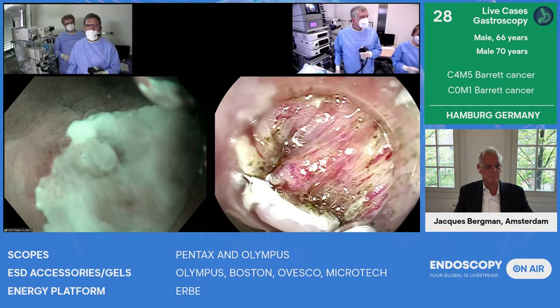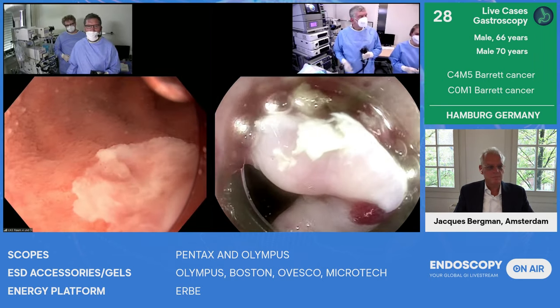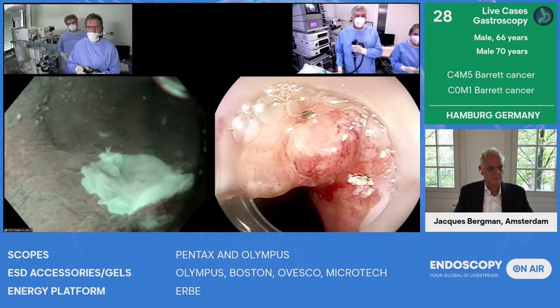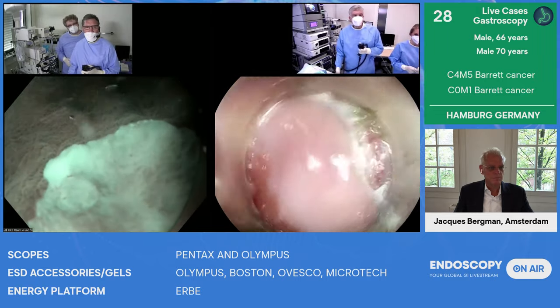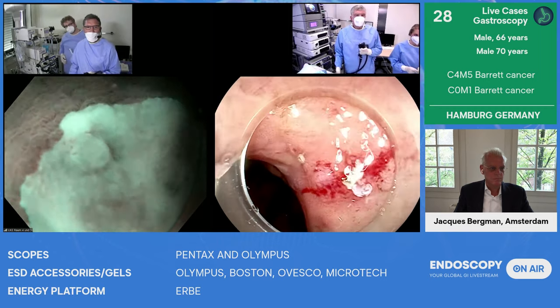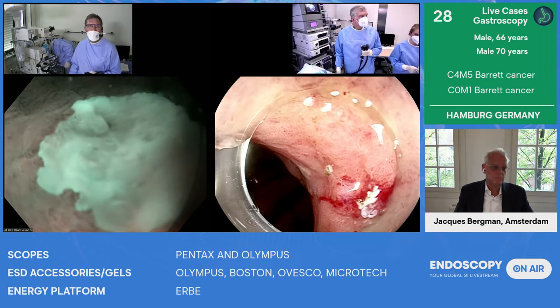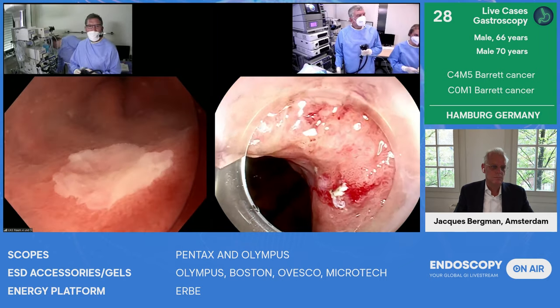And the only thing which is suspicious for me is, oops. No? Let's get this end behind it. The near focus does not work. I would like to use near focus, but there is a problem right now. I don't know why. Huh? Yeah, it worked. It's a shame that we cannot use it now. Helmut? The near focus system.